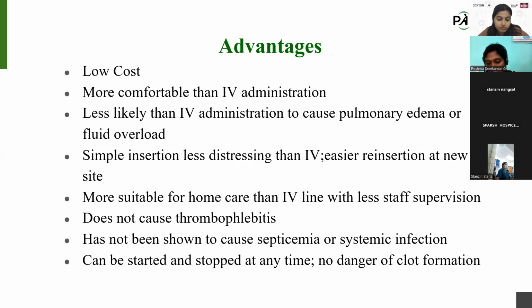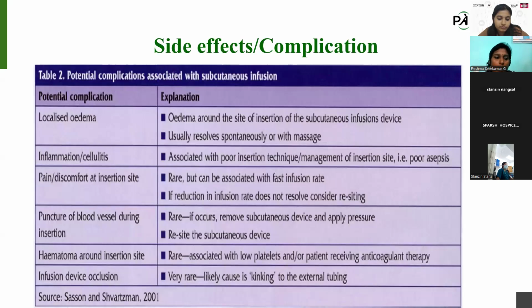Allergic reaction is very, very rare, because here we are using the subcutaneous route. And next is about some of the side effects and potential complications. One is localized edema.